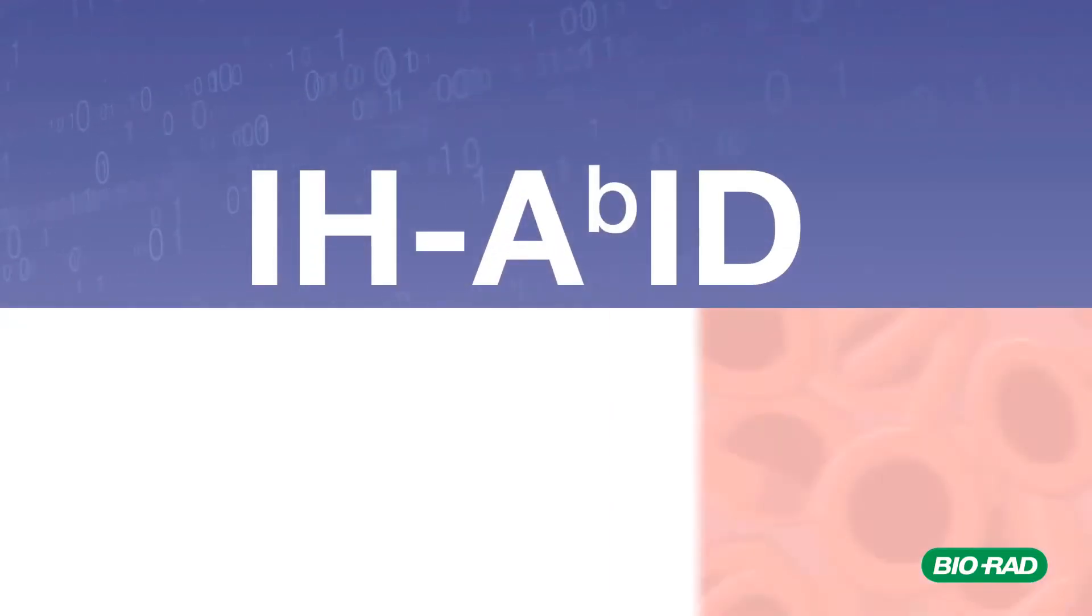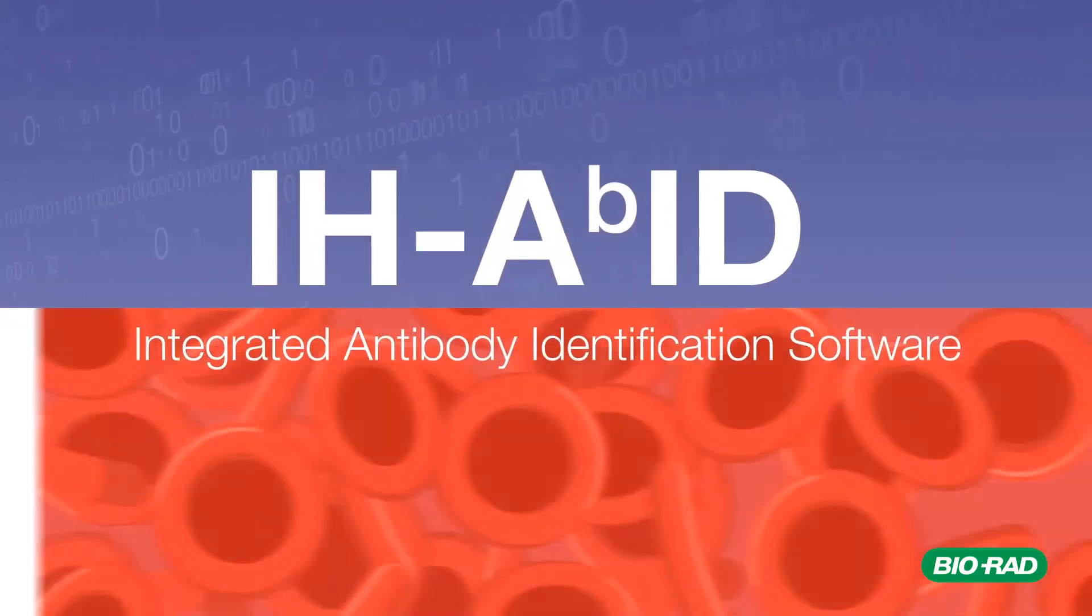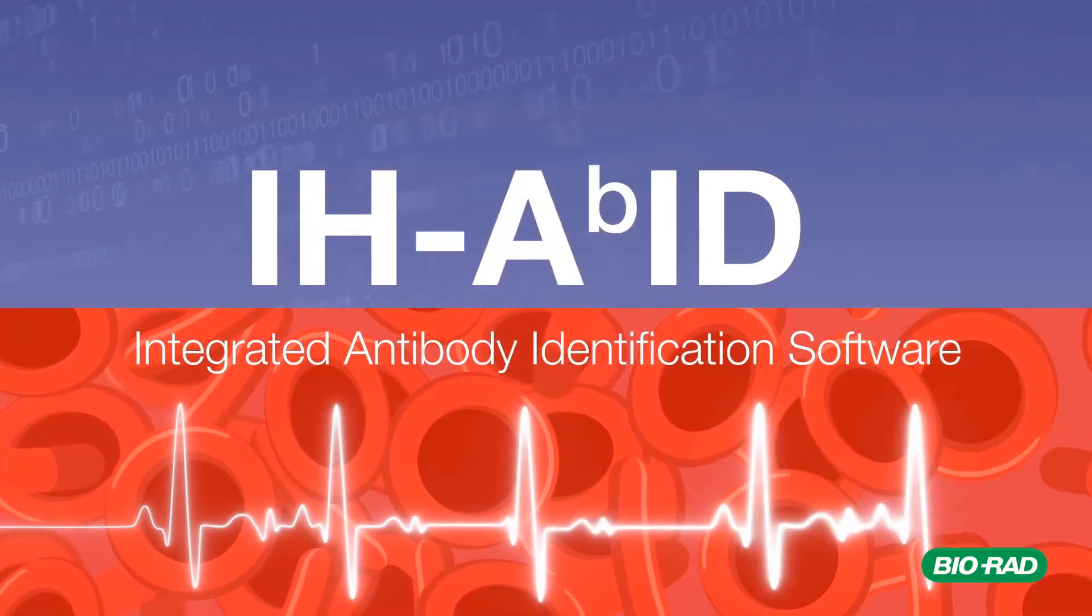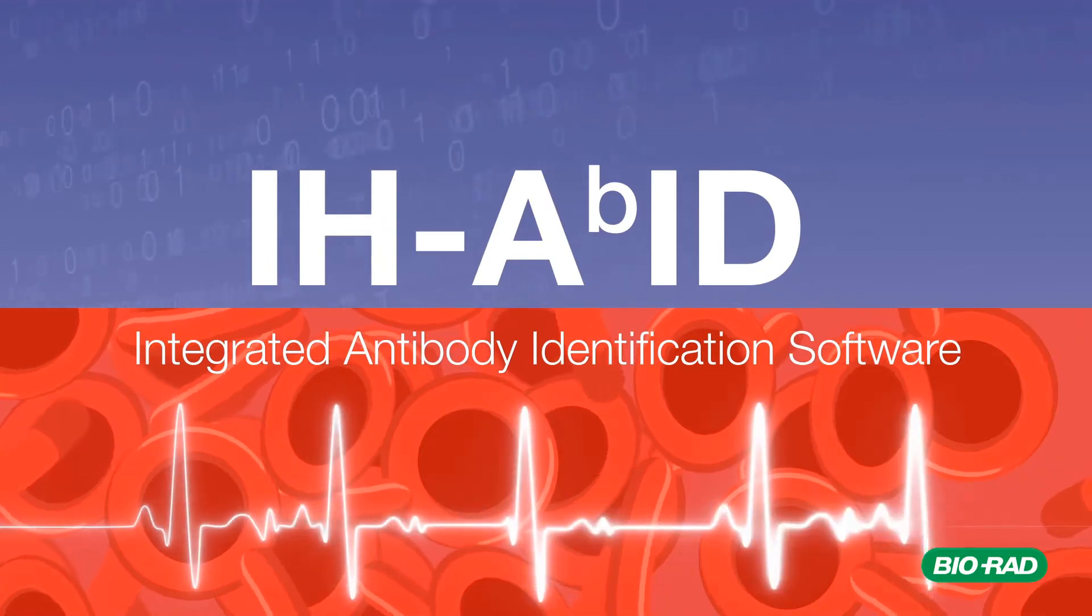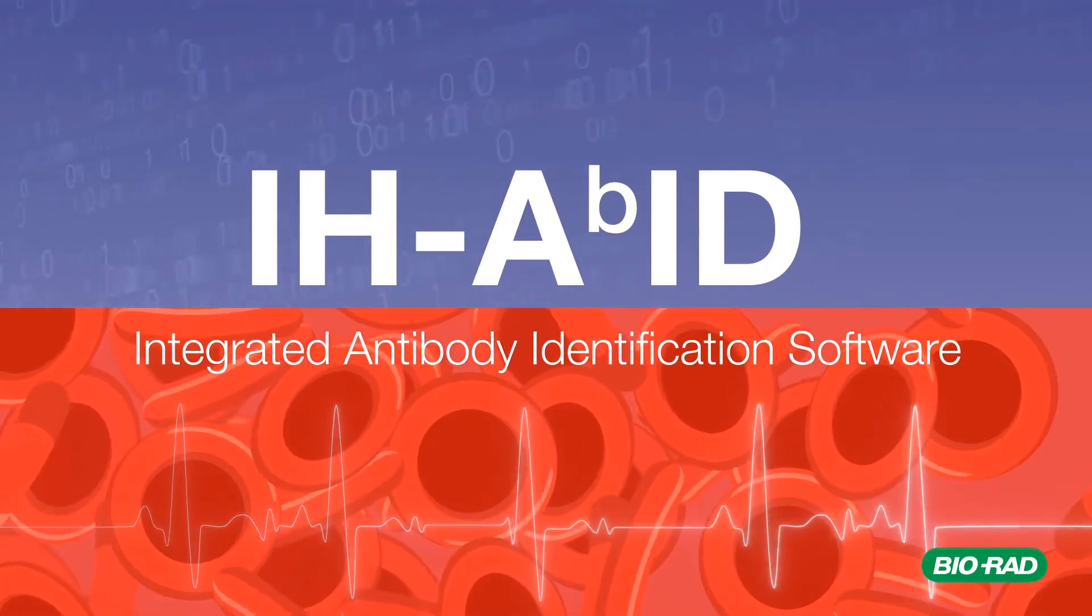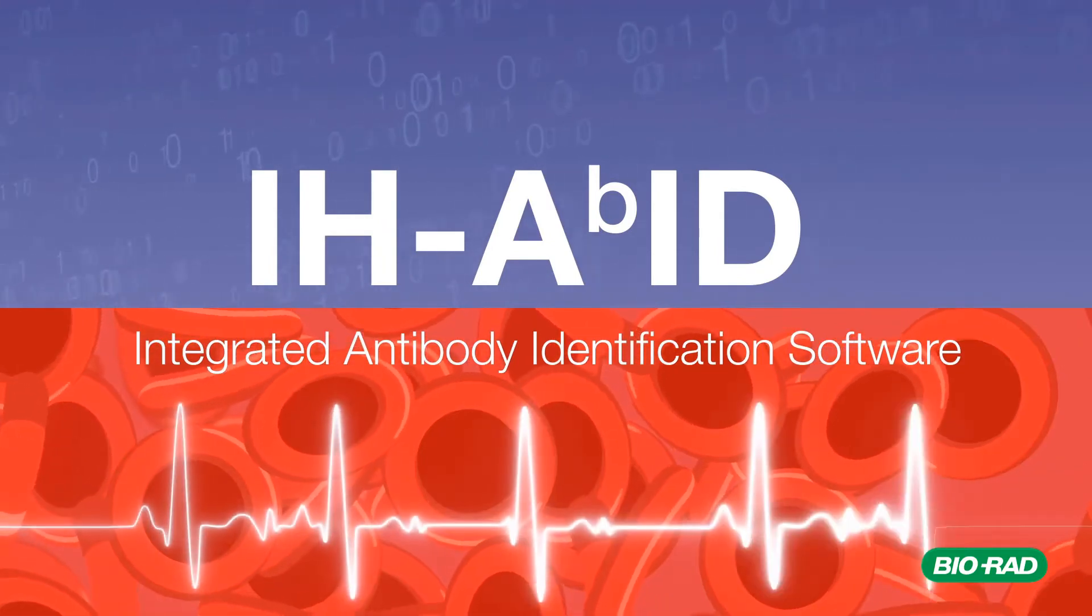Thank you for joining us as we provide a brief overview of the functions and functionality of Biorad's Integrated Antibody Identification Software.